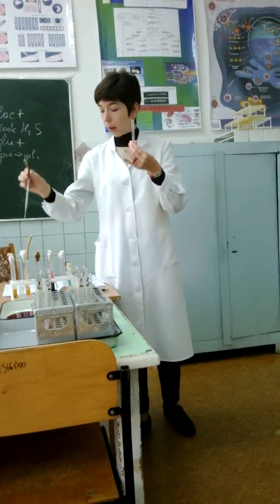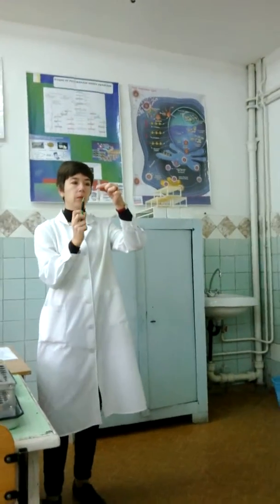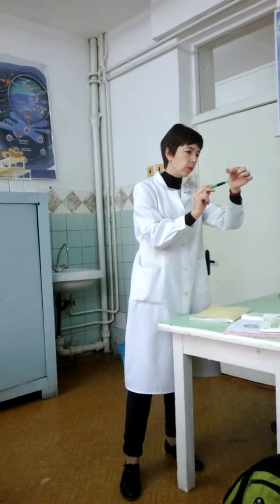Put it on this, and if the extract presents antigens, between these layers a turbidity ring forms. Yes, it's not very good, but it's a formation.